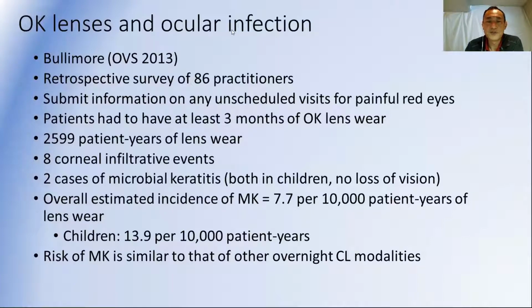And another question is, is there a lower limit of power to undergo Ortho-K? And there really is not a lower limit. However, if you're trying to do myopia control with Ortho-K lenses and you are correcting a very low refractive error, like a -1 or somewhere in that range, you're not going to create as much of that steep myopic ring in the mid-periphery, and that's what creates the myopia control effect. So you're probably not going to have as good a myopia control effect because of that.